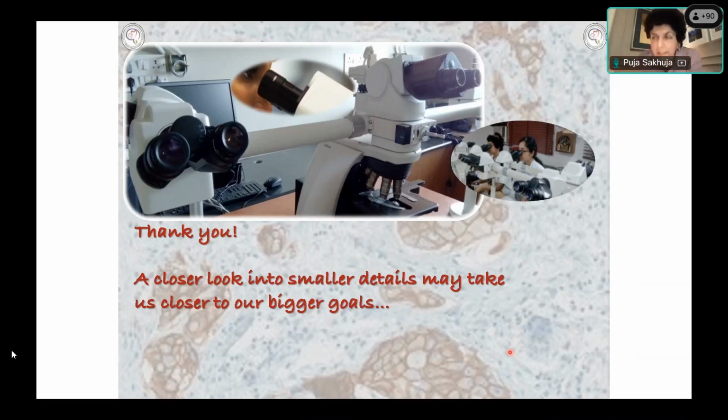So first just see these features and then you can say that there is no well-defined polyp, but these are the features that may be causing a polypoid appearance. And if you're seeing absolutely nothing, which is not uncommon, then you just describe it as it is and say that no definite polypoidal lesion is identified. And that does happen. Recently we had a case where there was something that looked like a fairly large polyp. When they took a biopsy, there was no polyp. But they had taken it from that polypoid region, which they showed us on endoscopy. So that was just a healing area.